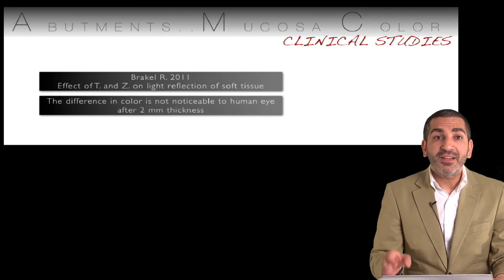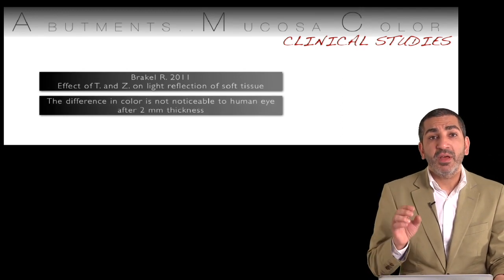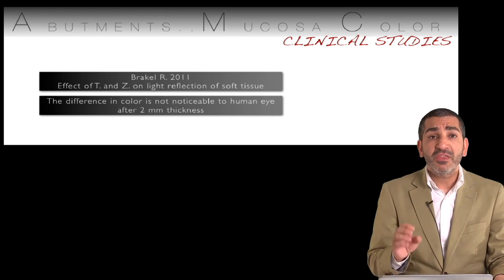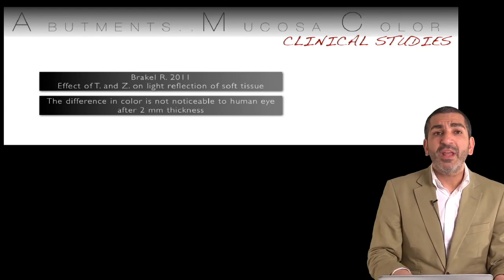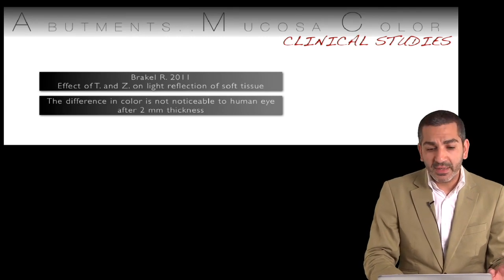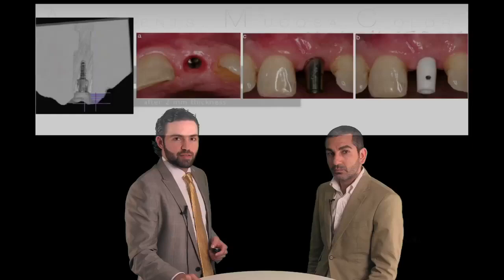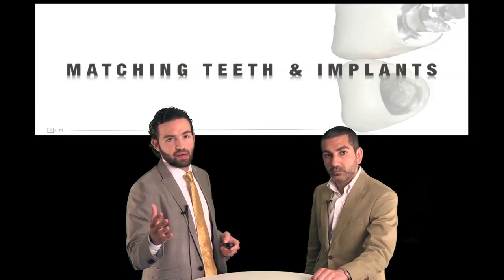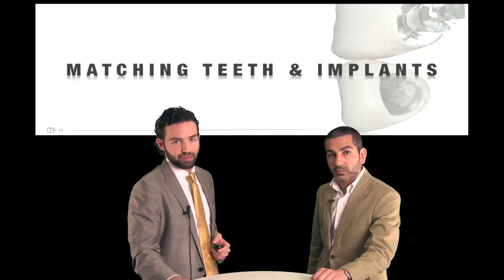Basically, the bottom line is that you need a 2 millimeter tissue thickness. As long as your tissue is 2 millimeters thick or more, you can use whatever you want as an abutment and it's going to look fine. So please remember that. So far we have covered all of the ceramic systems that are available in 2011.